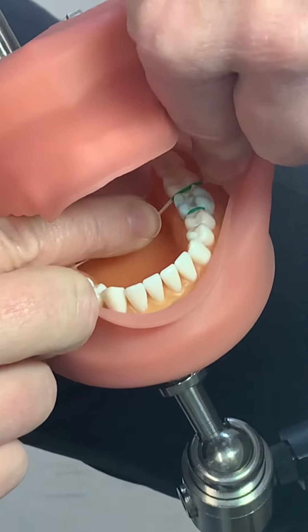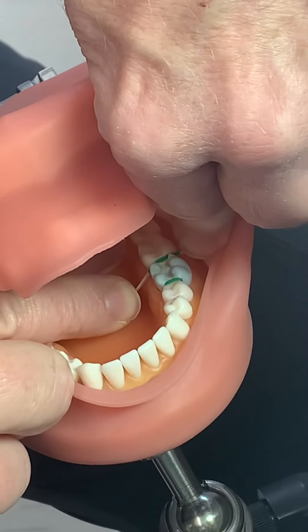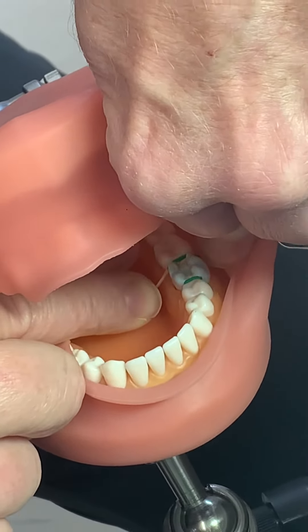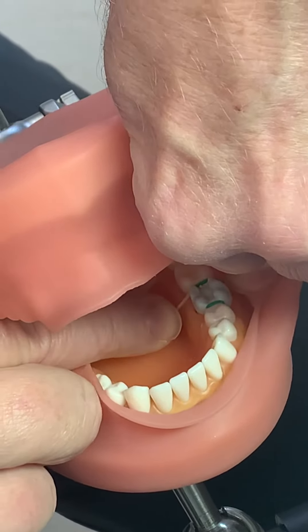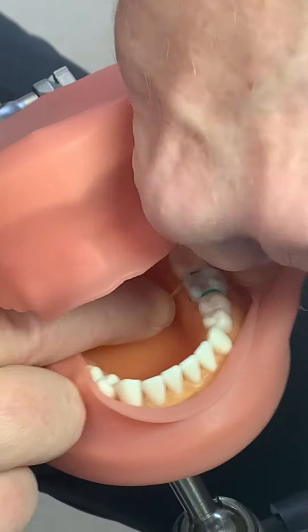Go in, down in between, and kind of slide back and forth. It's usually really tight, and that's why we have to put a separator in there. There we go.